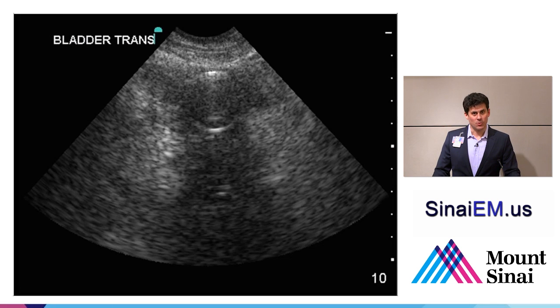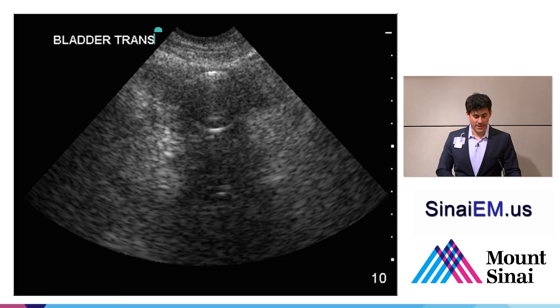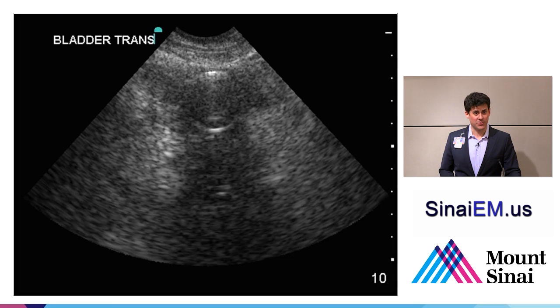You can visualize the bladder even when relatively empty by placing the probe right on top of the pubic symphysis and angling down into the pelvis. Occasionally you can see a circular structure — a Foley catheter balloon — allowing you to confirm the catheter's position. Sometimes a Foley catheter is in place yet you see a very large bladder surrounding it, indicating a malfunction or mechanical problem with the Foley catheter.